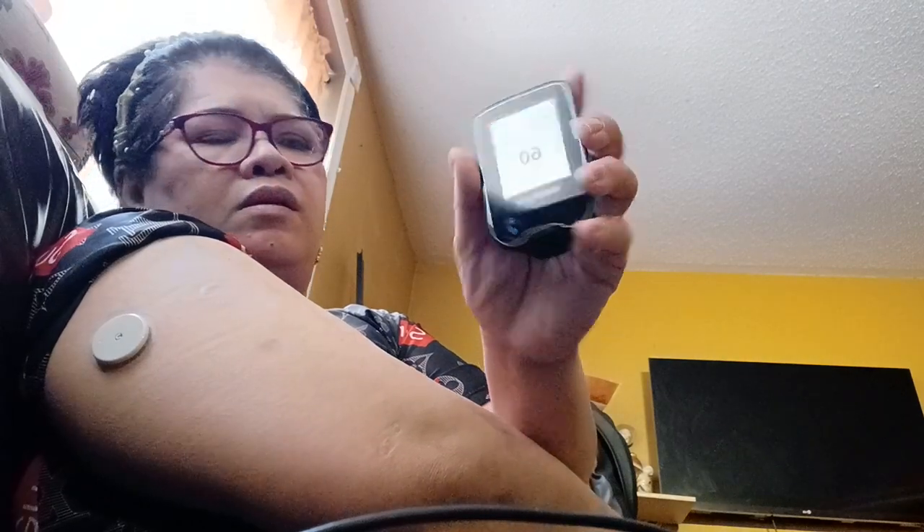That's it, and then you're ready to scan after an hour. You have to press 'Start New Sensor' and then scan it. You wait 60 minutes, which is an hour, so you can check your blood sugar. Press okay, and that's it guys — hope you like this video, bye!